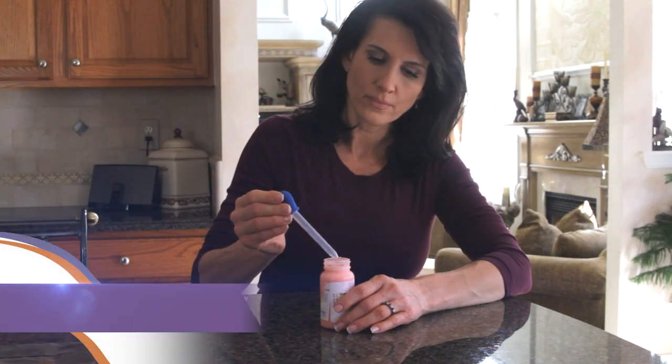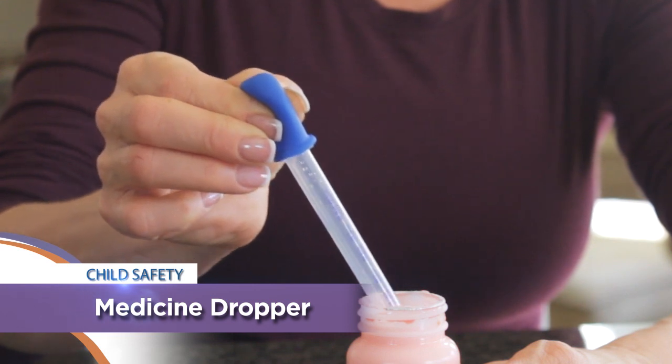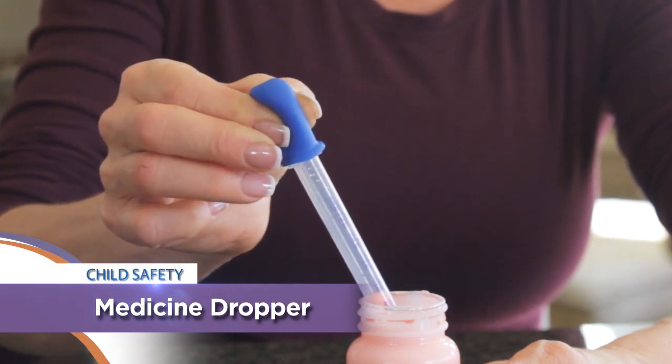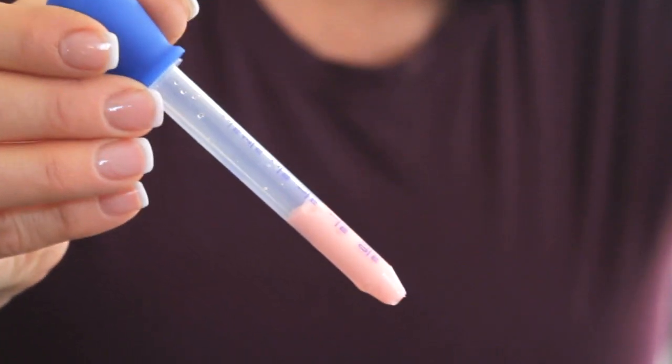The Medicine Dropper is easy to use. Simply squeeze out the air from the little bulb, place it in the medicine, and release the bulb until the proper medicine measure is reached.